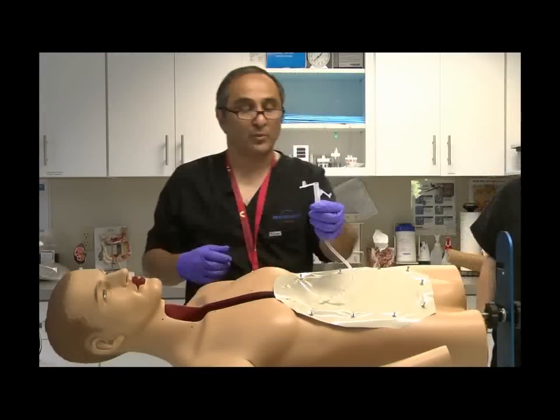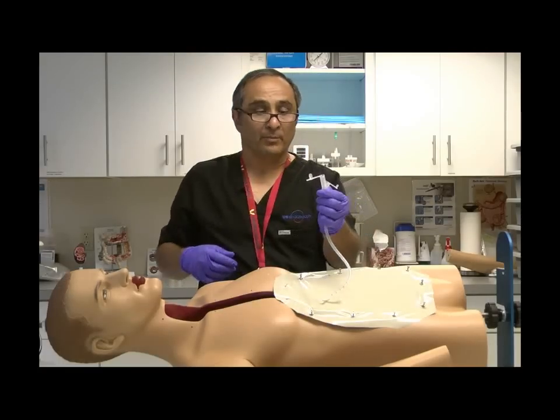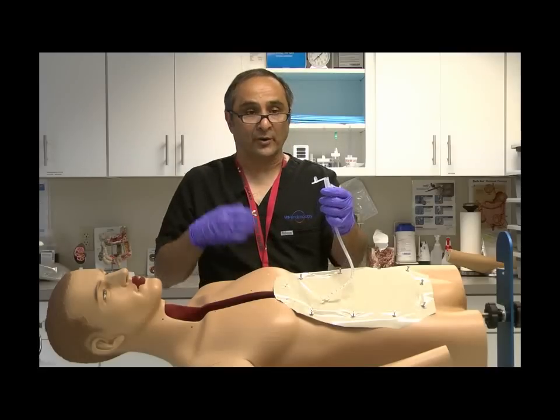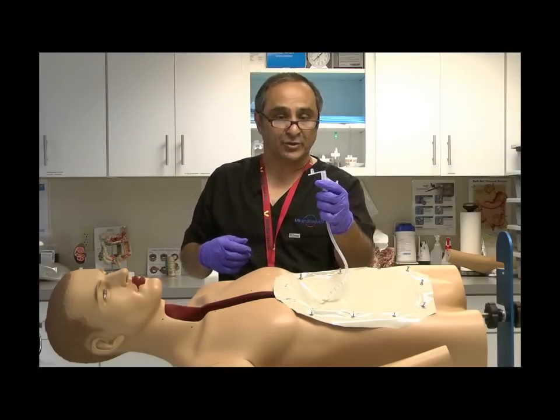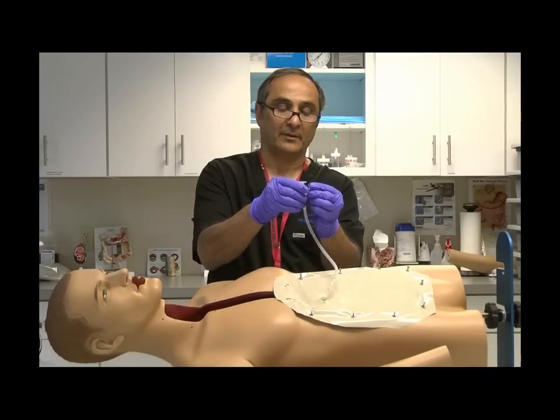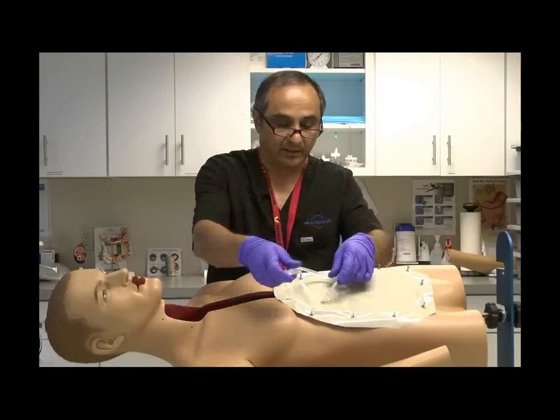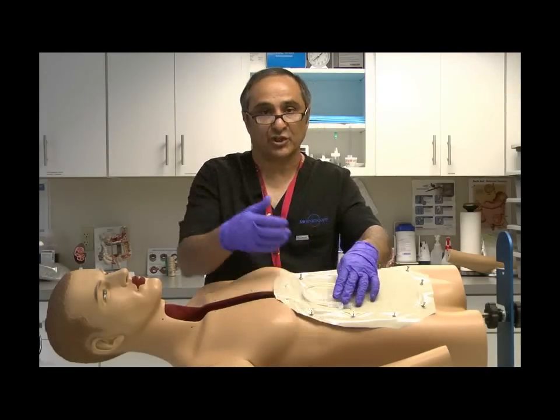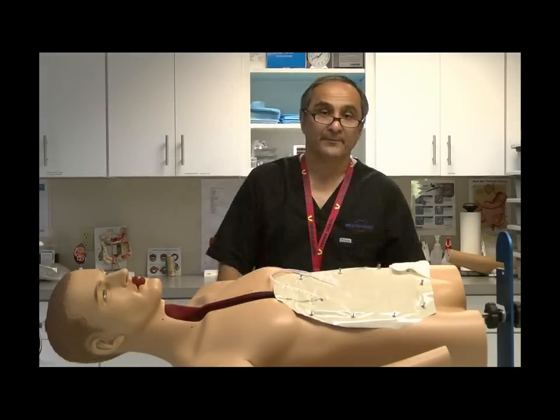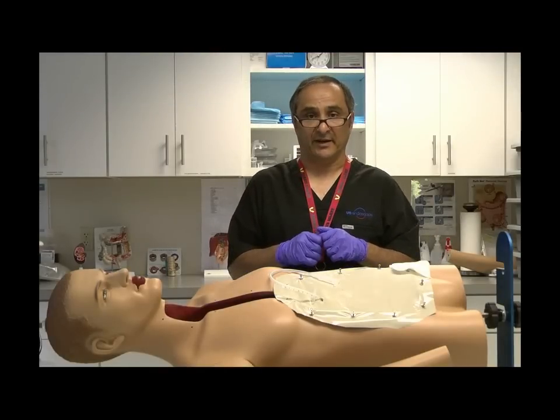As you know, the tube's Y-port adapter is already connected. At this point in time, the physician or care provider may want to insert air to confirm placement, or water to confirm placement, or to do gastric aspirate. And then just simply close the ports. And then the operator, or the end user, can tape down or secure the device as they normally would. So, that was the technique for proper placement of a non-balloon replacement peg device.